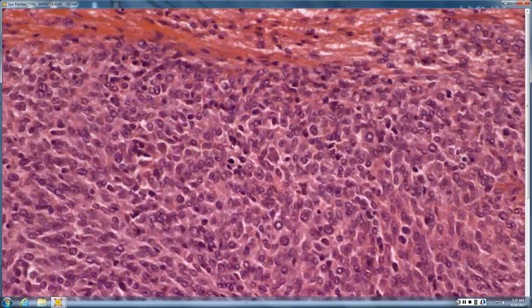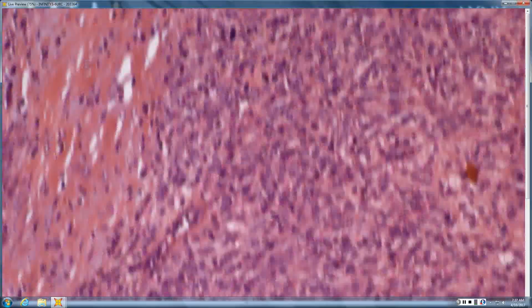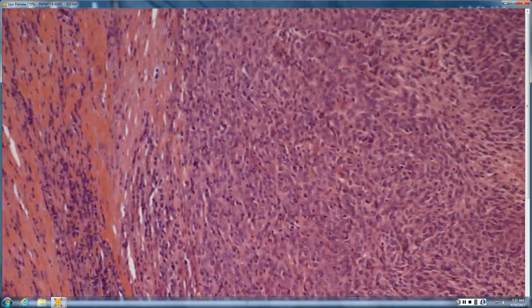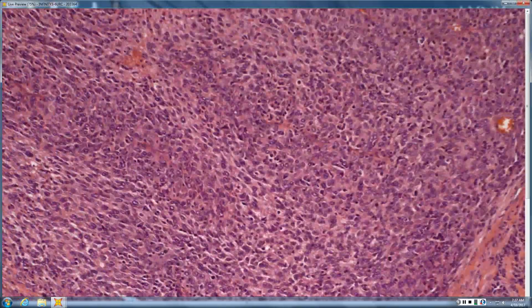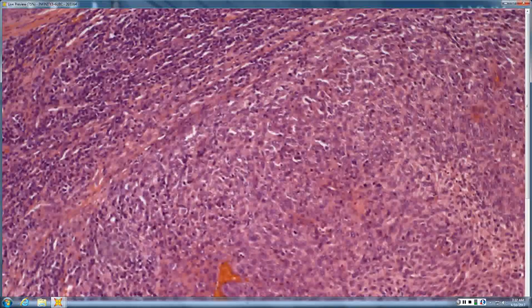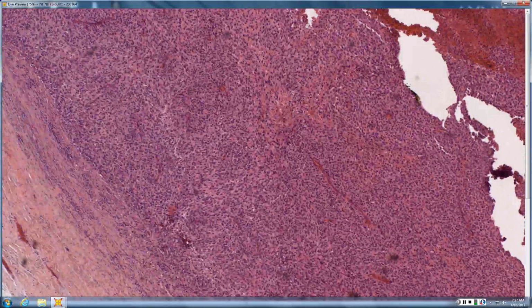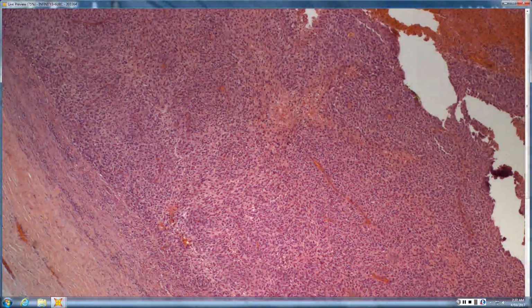Let's see, so what kind of cells are these? Kind of large open vesicular nuclei. I mean, could it be a melanoma? Perhaps. Yeah, so you're probably going to do immunostains to confirm. I don't see good rhabdoid morphology in these, but certainly it's metastatic something that's kind of spindled and epithelioid. Staining for epithelioid sarcoma, loss of INI1 staining, co-expression of keratin and vimentin would certainly be reasonable for this. This one ends up vimentin positive, keratin negative, and is also SOX10 positive. So is that like a melanocytic? Yeah. So it's pretty good for melanoma. So, just big nodular met.